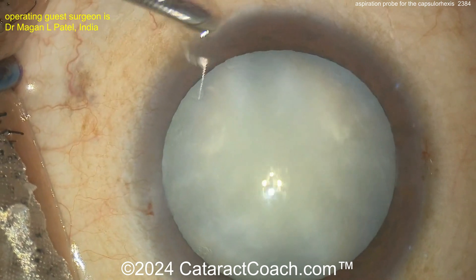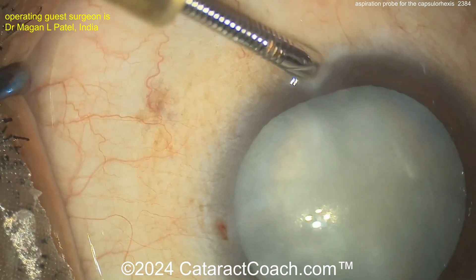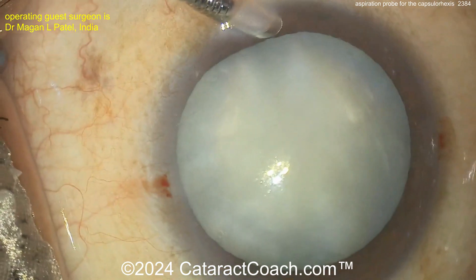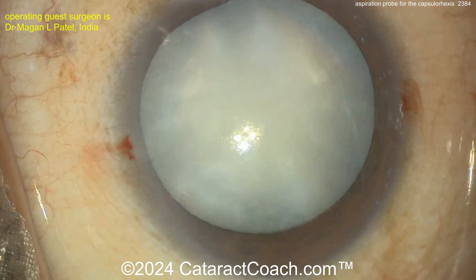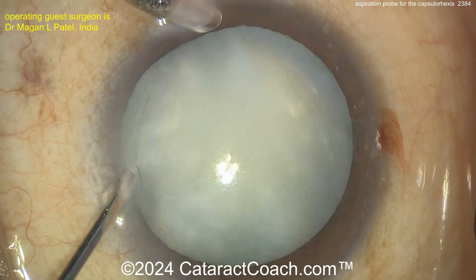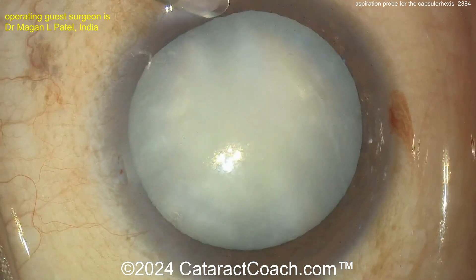Here we go — white cataract. The surgeon is starting off with an AC maintainer. Probably some Trypan Blue dye, or maybe that was already done. It looks a little bit blue already. The technique here is to use two paracenteses, two small incisions.